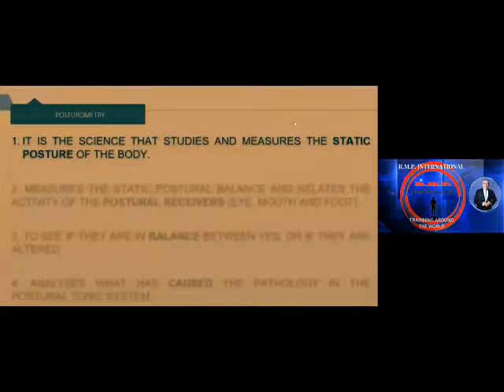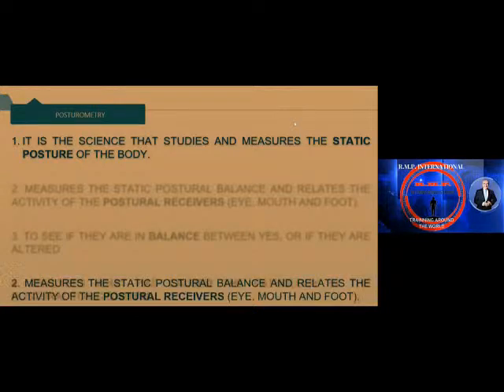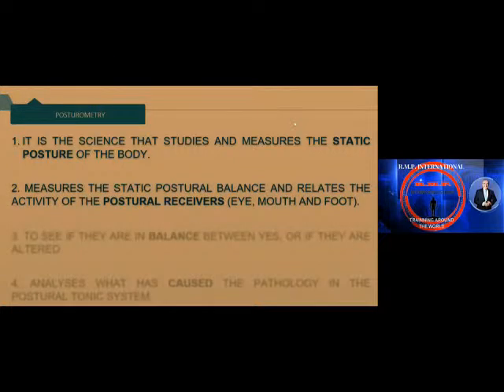Posturometry is a medical science. It is a proven study that studies and measures the static posture of the body, measures the postural balance, and relates the activity of the postural receptors: eyes, that means the oculomotor system; mouth, that means the craniofacial system, a big disturber of the posture; and foot support.